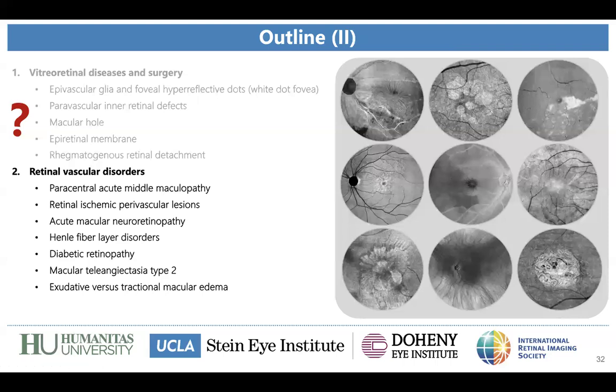Gabriel, thinking about a research topic that would be very useful, not for identifying the pathophysiology of the disease, but for introducing the application in real life: let the device do its thing and check its capability of diagnosing and helping, and the real utility of the en face of each segmentation.